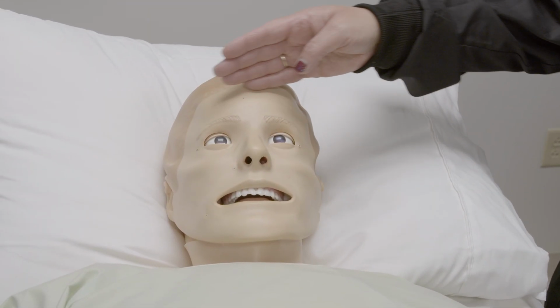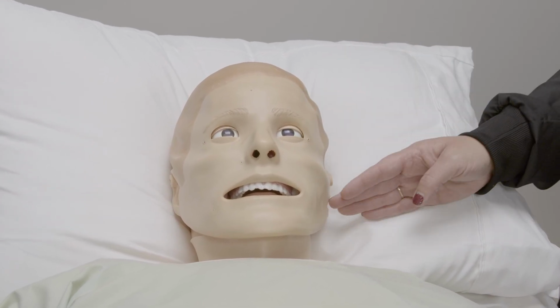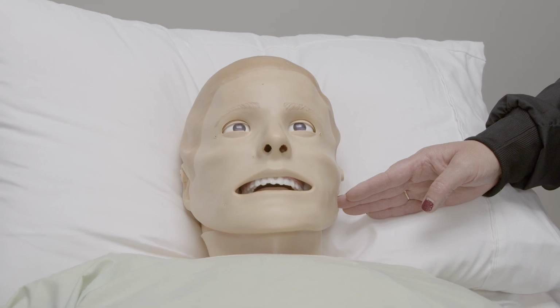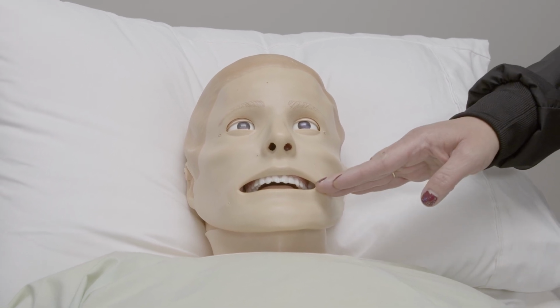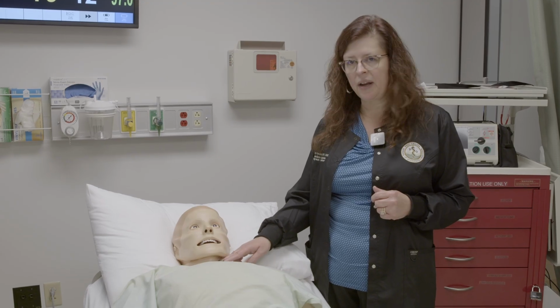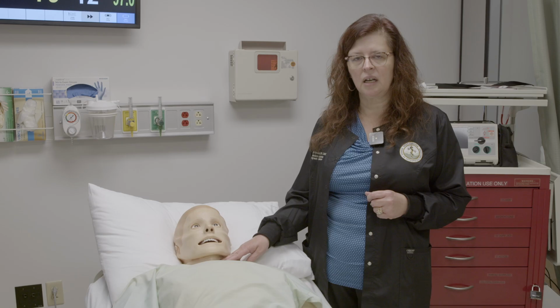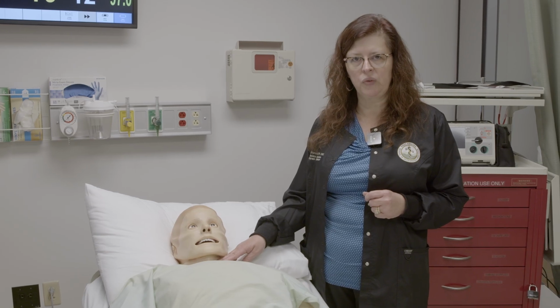The simulator has the ability to sweat, to cry, the eyes react to light, he can leak blood or cerebral spinal fluid from the ears. The tongue can swell to mimic an anaphylactic reaction. The simulator can be intubated and have a cricothyrotomy performed. He has an extensive library of heart, lung, and bowel sounds to mimic many different illnesses. He can have unilateral or bilateral chest rise. He can have a needle decompression or chest tube placement performed. He can also have a Foley catheter placed for urinary output.